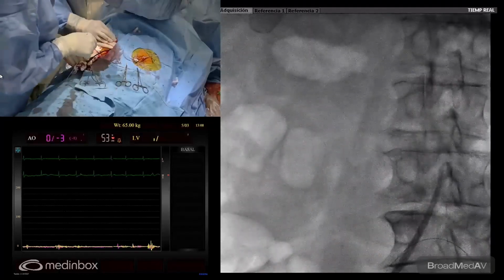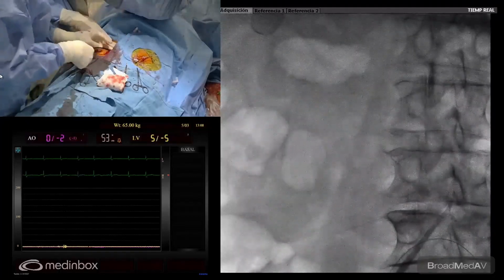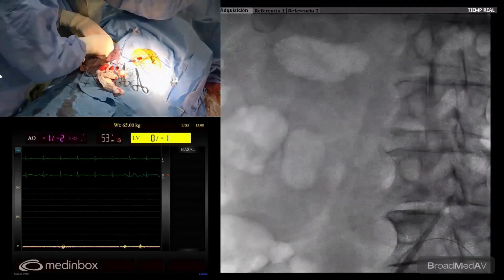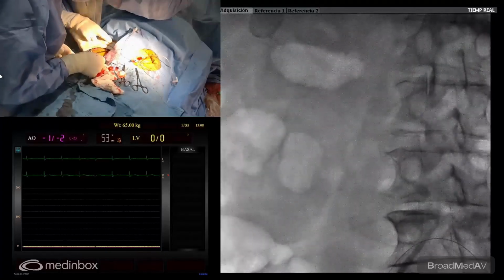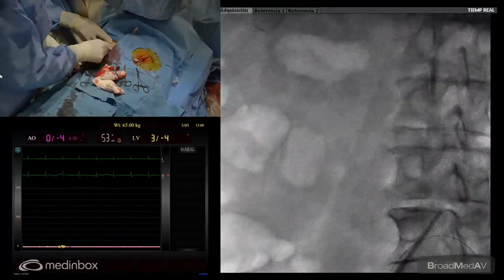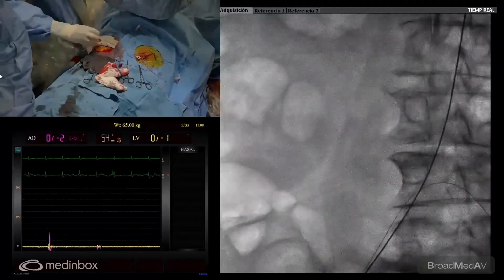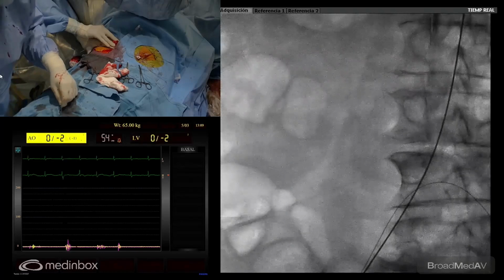And now we are going to introduce. This is the more difficult part because it's not marked, the orifice. So sometimes it's a tactile sensation. Or you might need a light that I was trying to prevent, but I need it. Yeah. Here. Perfect. So now we introduce the wire. And one is gonna hold the groin. We are going to pull the wire, the ProStar out. And we are going to put the 14 French introducer set.